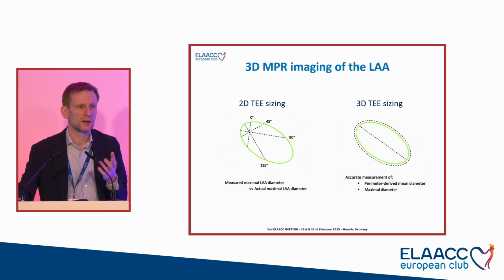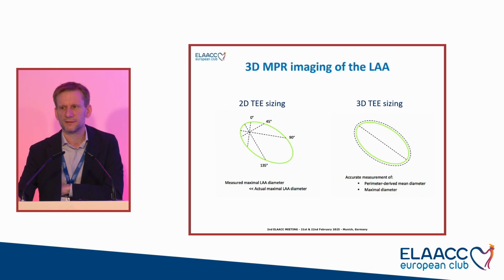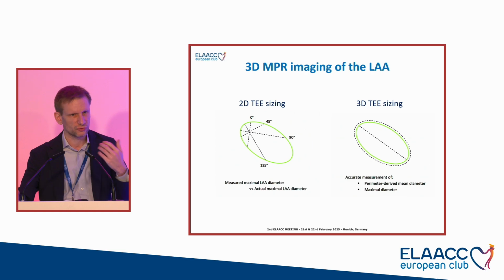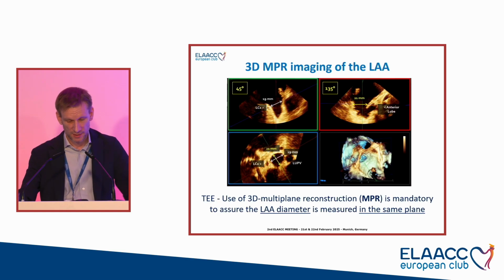So I'm even a little bit disappointed, to be honest, in the companies, that over all these years they don't come up with stronger recommendations to do the imaging and the sizing using 3D modalities. I think it's a responsibility of the companies also to teach customers, even if they're not high-volume customers, to train and advise the best practice. I think it's a responsibility they don't take.